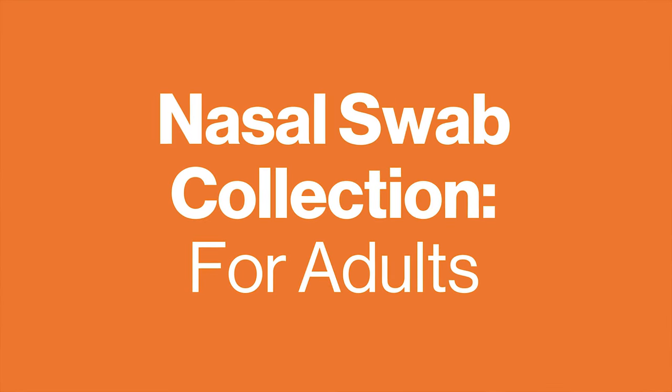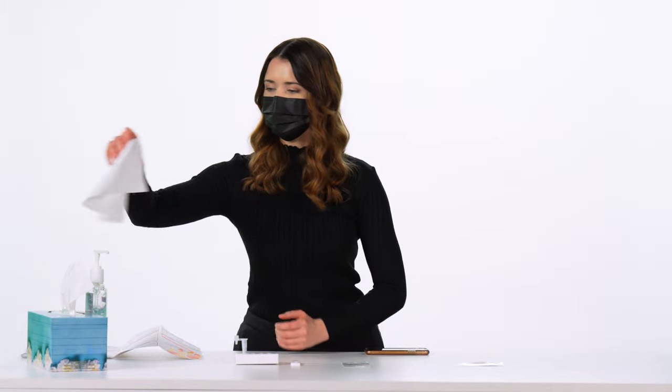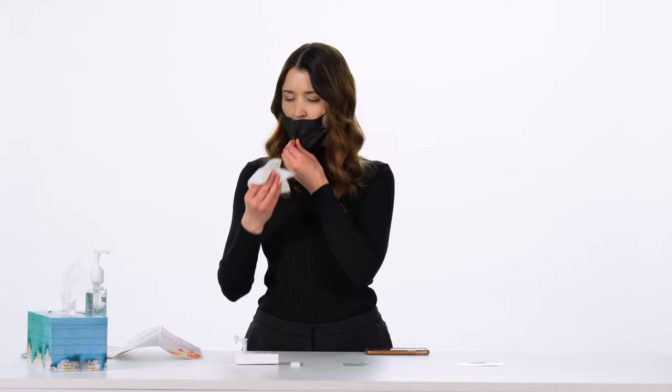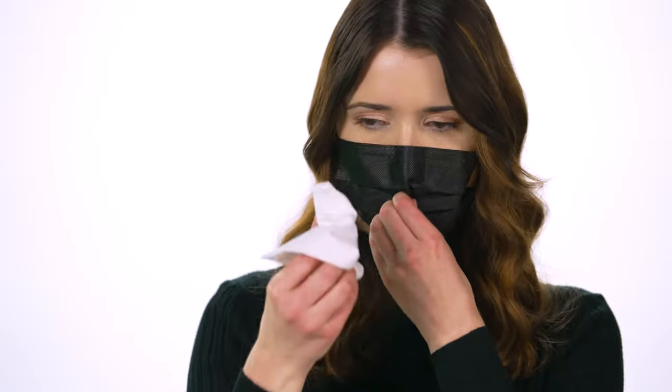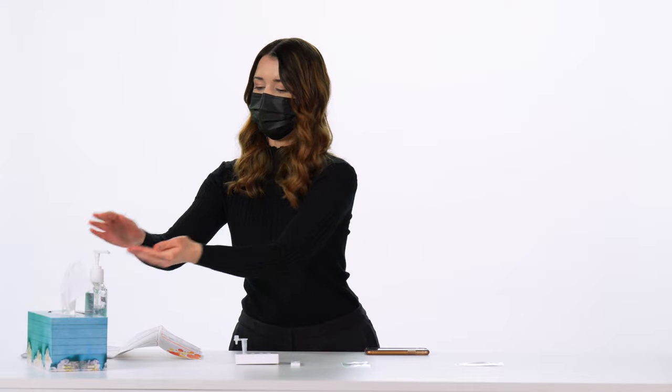Nasal swab collection for adults. Gently blow your nose into a tissue to remove excess mucus and discard the used tissue in the garbage. Avoid using bloody samples as blood may interfere with the test. Then wash or sanitize your hands again.